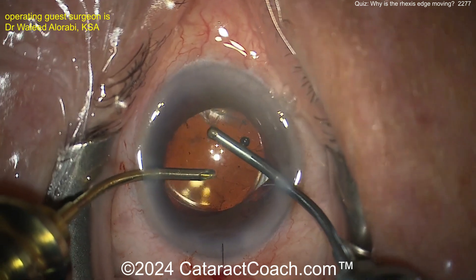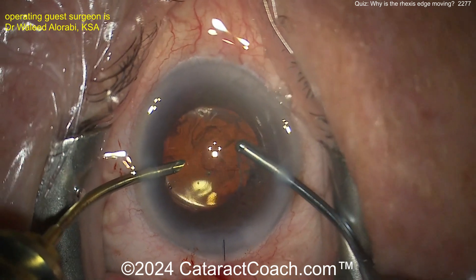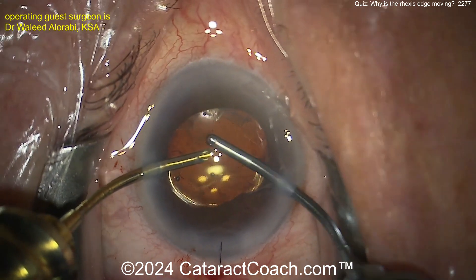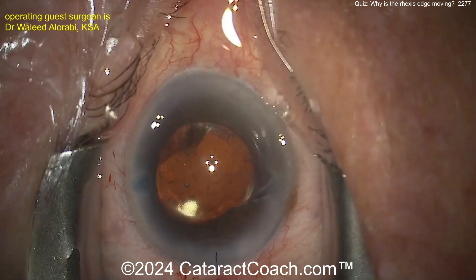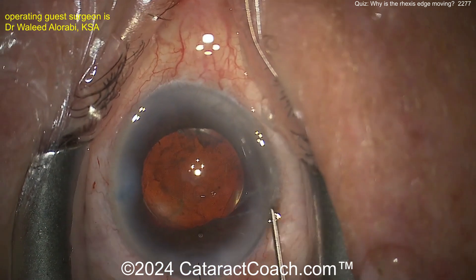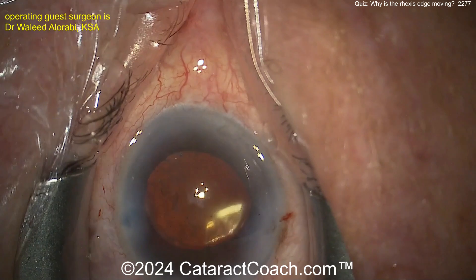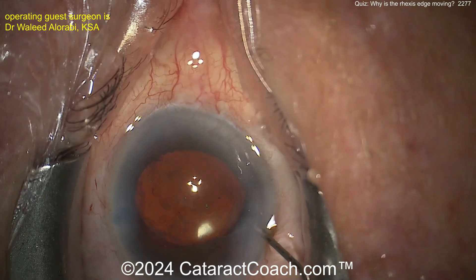Viscoelastic has been removed, but I'm not so sure about the stability of this. Is it totally stable? The rhexis is still kind of moved in a bit. I'd wonder if there is vitreous prolapse — probably. I'd say put some triamcinolone in now just to see: do you need to do a little vitrectomy? Do you have enough support here? It looks reasonable perhaps.